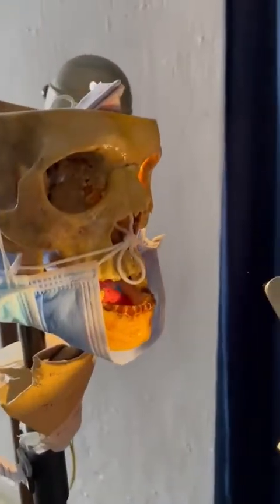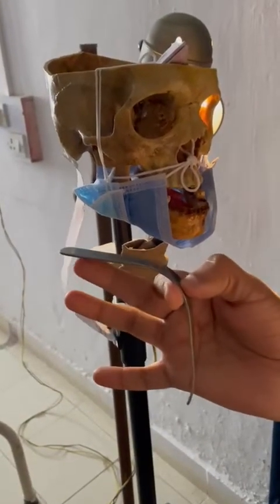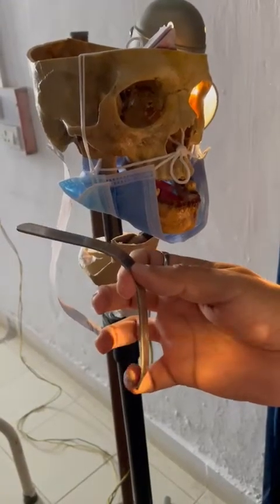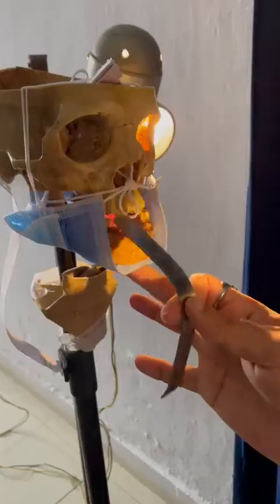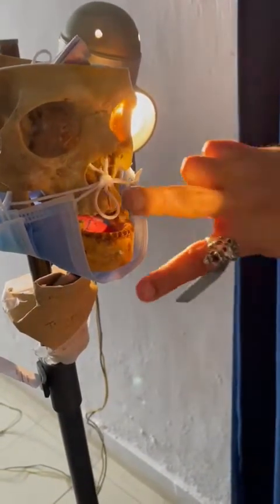Welcome to ENT Student. We are covering EN 2.6: use of the tongue depressor. You hold it like this — one surface rests on the tongue. This surface is used to retract the soft palate during anesthesia or in the supine position. You use the chin as a fulcrum and introduce the depressor inside at the angle of the mouth.